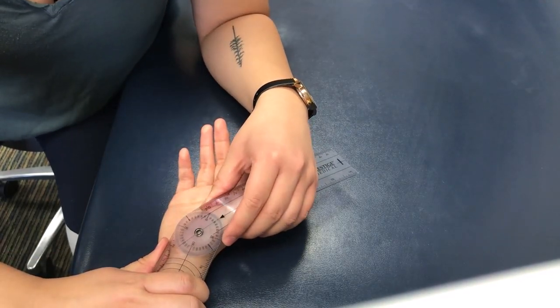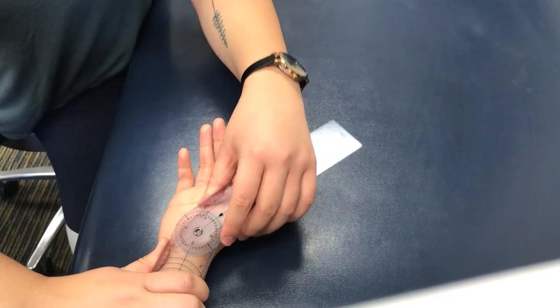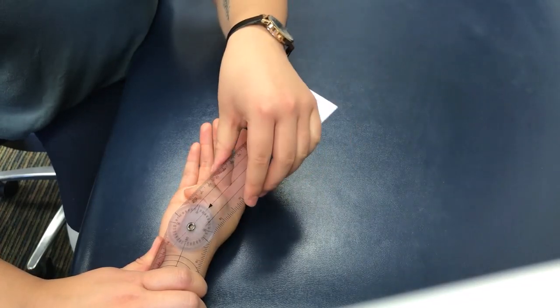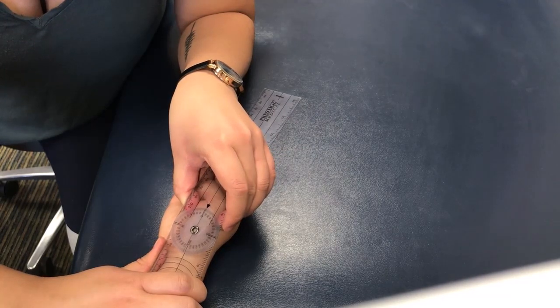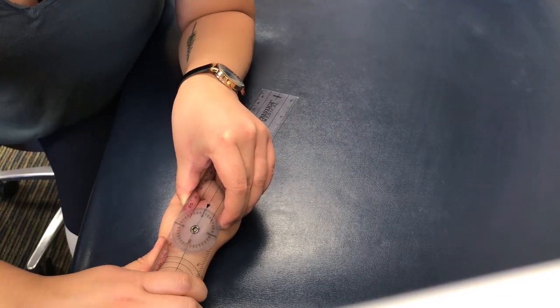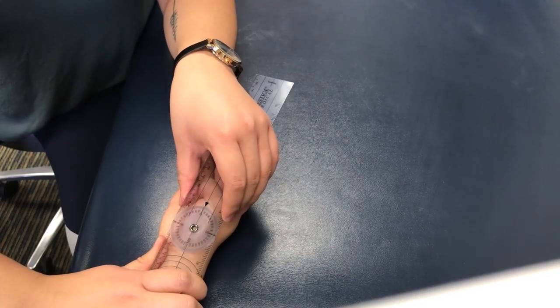And then I'm noting that we're starting at 30 degrees. And then go ahead. For active range of motion, you're going to bring your thumb across your palm like this. And we're at 2 degrees. So the difference between 30 and 2 will be 28.